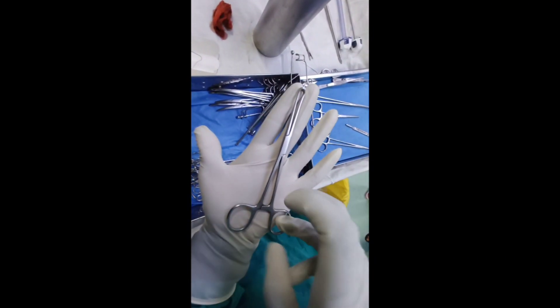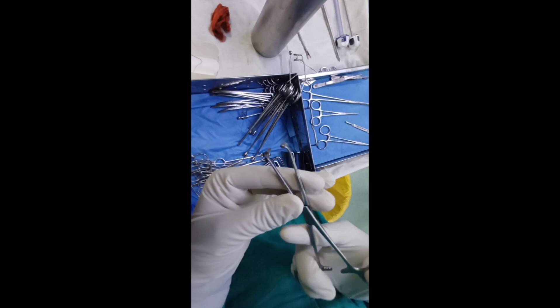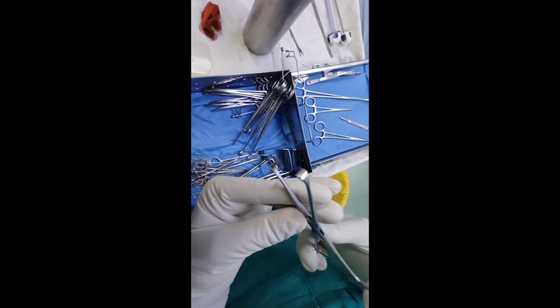This instrument is made up of stainless steel with two finger bows, ratchet, shank, box type of joint, and jaws containing toothed structures which can be interlocked.